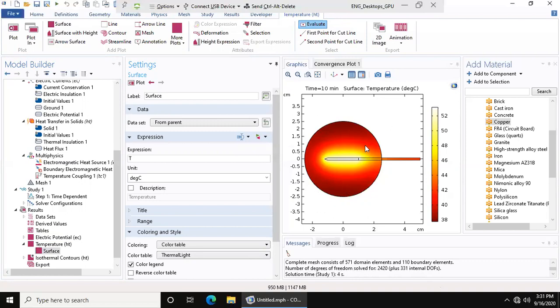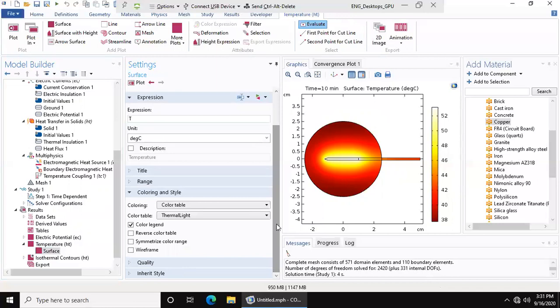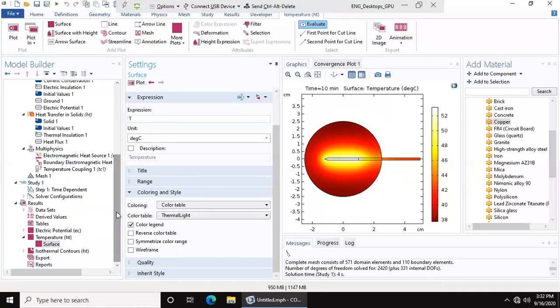But you have a good area that is above the required 45 degrees Celsius, and these cells are going to die. Also, in newer versions of Comsol, there is a tissue damage module, but I'm currently not using that, because the students I am doing this for are going to be using this model on Comsol version 5.3, which they will not have access to. But you could determine the tissue damage as well.